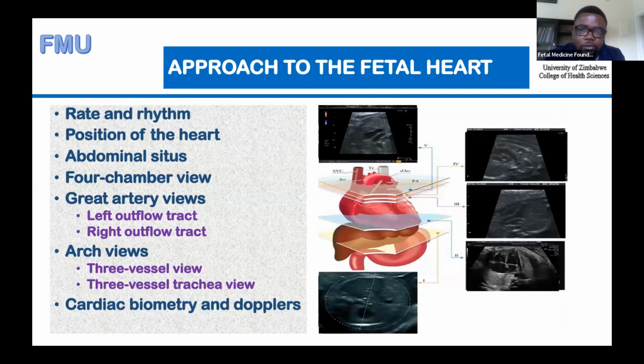So knowing how to do a fetal heart examination properly is important. Sometimes people just look for something which is beating within the baby's chest. They put the pulse wave gate, whatever tracing they get, all they want to do is to measure the heart rate. But if you practice like that, unfortunately, you are going to miss a lot of fetal cardiac arrhythmias.